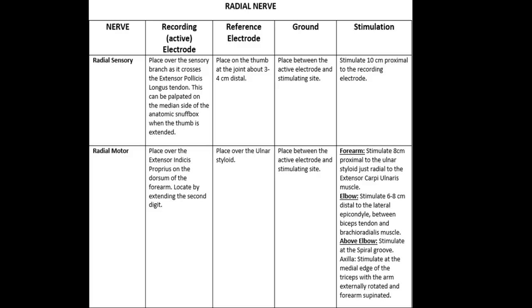Besides medial antebrachial cutaneous and lateral antebrachial cutaneous nerves, because those give us the idea, is it the medial cord affected or the lateral cord affected? And for the posterior cord, it's a radial sensory. So if you do 3, you already know what part of the cord is affected. And actually, you can do the needle exam to localize it more, but that is kind of a screen when we talk about brachial plexus injury patients.